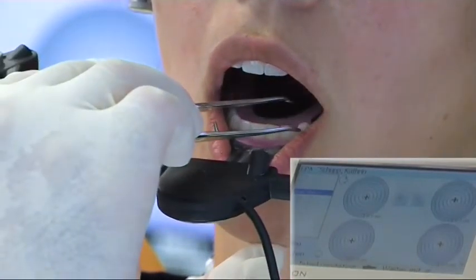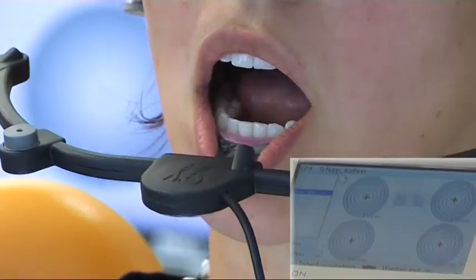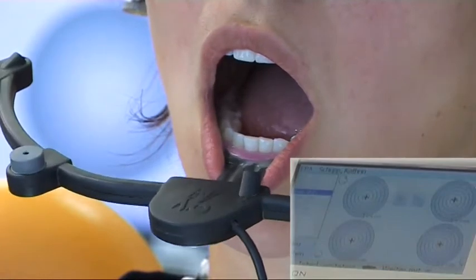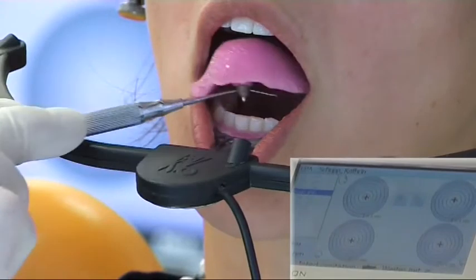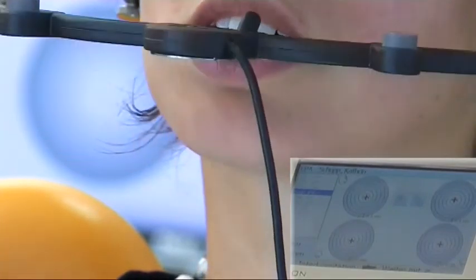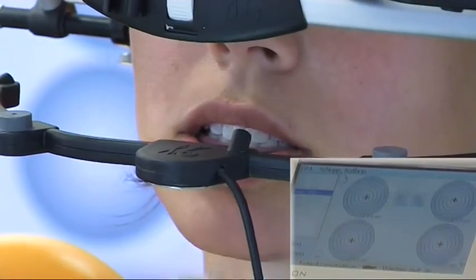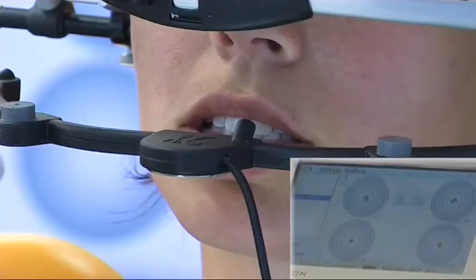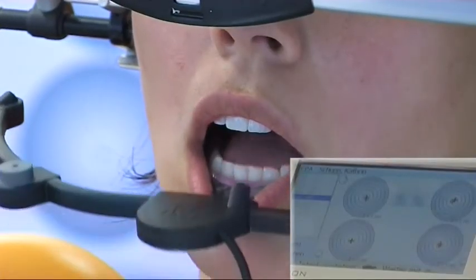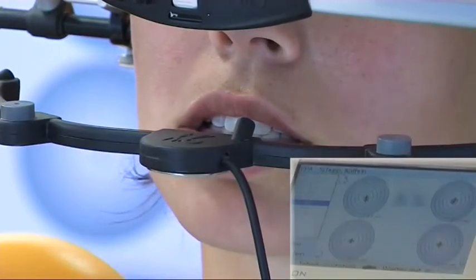The patient is instructed to open and push the lower plate up with their tongue, then bite down. The patient closes in maximal intercuspidation and the position is measured. The open-and-close sequence is repeated, and thus we have measured the maximal intercuspidation three times.